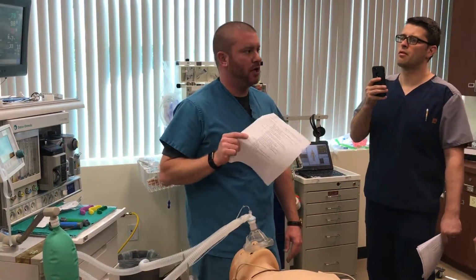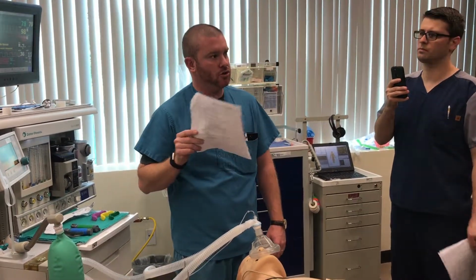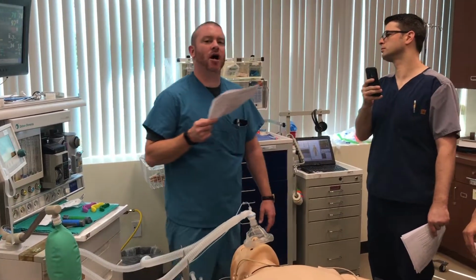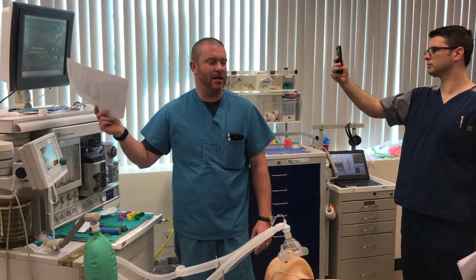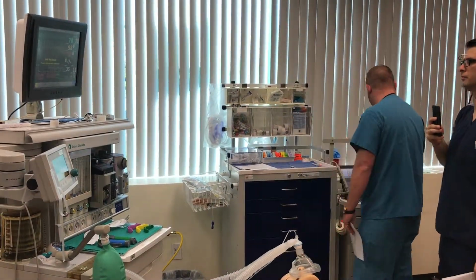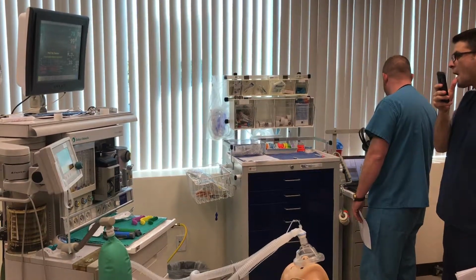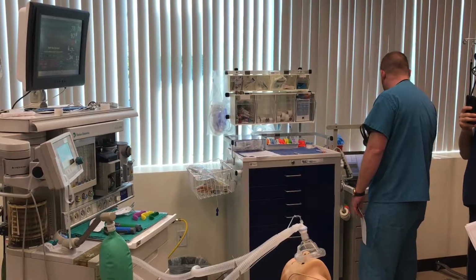Who thinks I'm ready to do an induction? Who does not think I'm ready? You're shaking your head no. Nobody knows, Keith. Why? Tell us why. Is it your end-tidal oxygen? My end-tidal oxygen is not sufficient. It's 15%. What do I want my end-tidal oxygen to be before I push? 80%. Why 80%? Gives you a little room, because we've fully denitrogenated or pre-oxygenated the patient. We want that FRC saturated with oxygen.